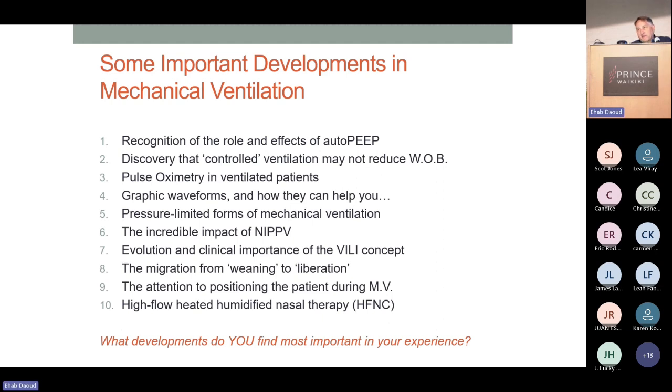I think, similar to what Rob said, smarter and smarter mechanical ventilators that ultimately will take a number of the decisions out of our hands, based on intense monitoring of the physiology and guidelines based on things that we know work. So the ventilator will tell us the tidal volume that's best for that patient and the flows and the settings. So I think these feedback things are inevitable. Obviously, we've been held back by restrictions by the FDA, but one day we'll have all that.